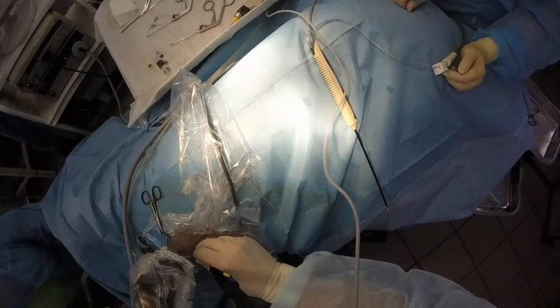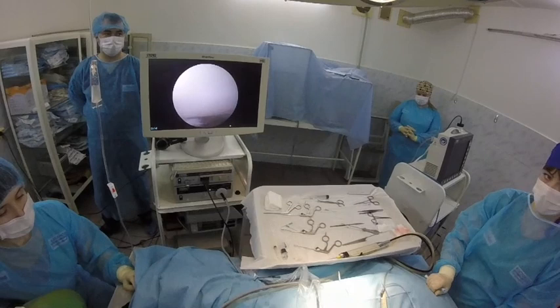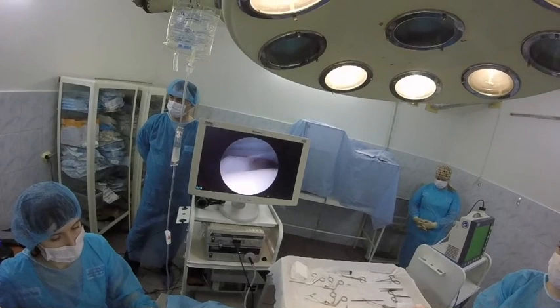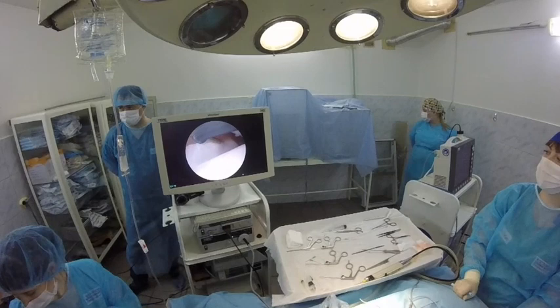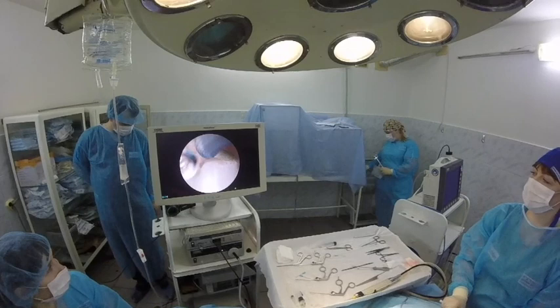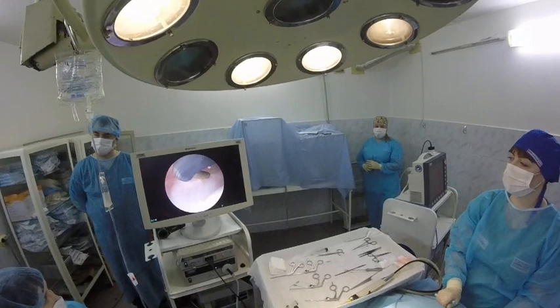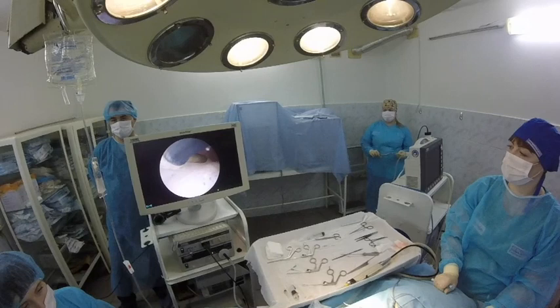I find a very interesting situation — I find a rupture of the subscapularis tendon. Look here — yes, we find rupture of tendon subscapularis muscles. So we need to do thermocoagulation of this place. Let's do it.